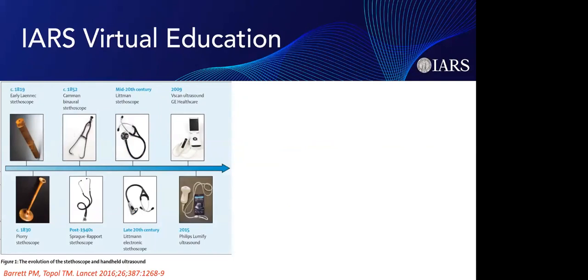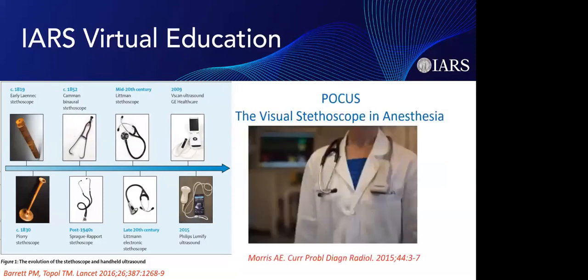And the stethoscope has been modernized over the past decades into the late 20th century into the electronic stethoscope. However, in the 21st century, portable ultrasound has become increasingly used in the field of medicine. In fact, ultrasound, or POCUS, has been known as the visual stethoscope in many fields of medicine as well as anesthesia.